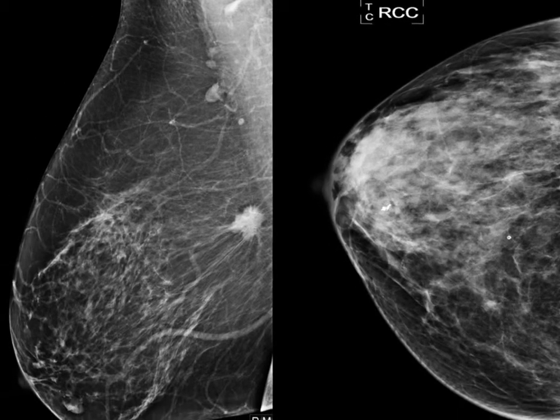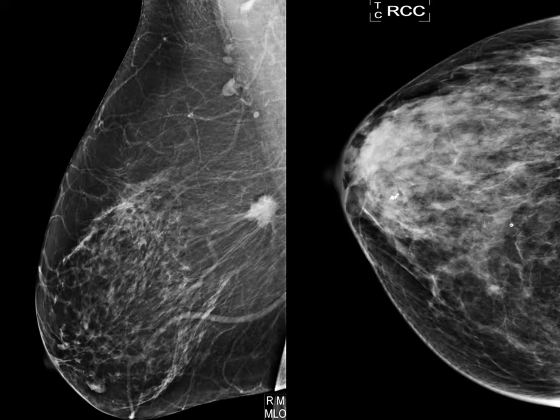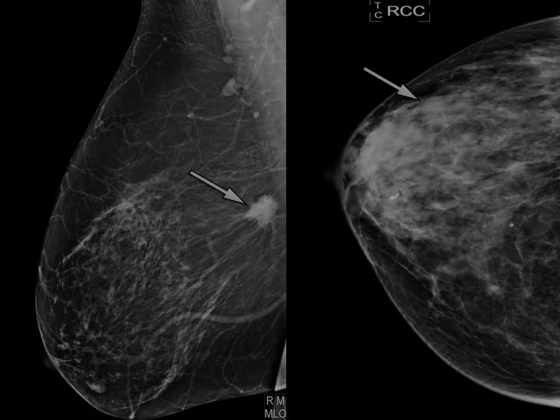Why was the cancer on the right more difficult to find? Look at the two films. What do you notice about them? The film on the left is mostly dark, whereas the film on the right has a lot of white density. Note that both cancers are also white. The cancer on the right is hard to spot simply because it is difficult to see a white cancer against a white background. This white background is called increased breast density and is found in about 20% of the female population. It is the most common reason why breast cancers can be missed on mammogram.